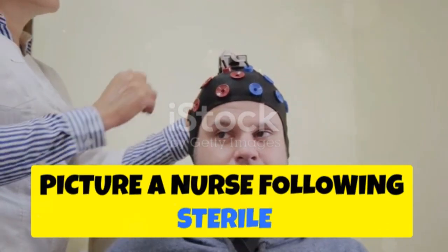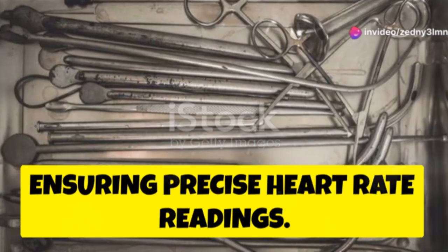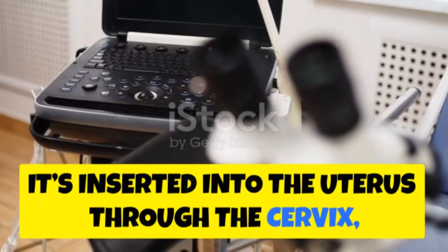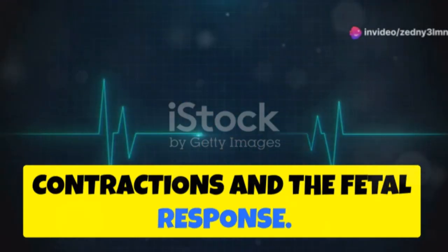Picture a nurse following sterile procedures to attach the electrode to the fetal scalp through the cervix, ensuring precise heart rate readings. The IUPC measures the strength of uterine contractions. It's inserted into the uterus through the cervix, often alongside the FSE. This helps us assess the intensity of contractions and the fetal response.